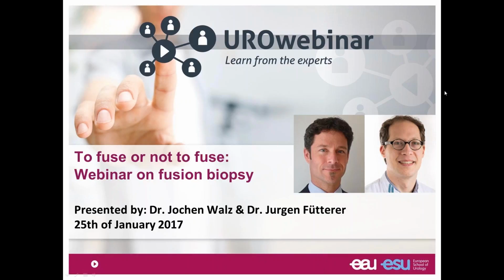Go ahead. So what we know from literature, also from our own experience, is that if you have a patient with rising PSA and a negative first TRUS biopsy session with 10 or 12 cores, in general we only perform MR targeted biopsy of the lesion rather than sampling the entire prostate. If you look at the comparison between TRUS-guided biopsy versus MR targeted biopsy, I think the yield is significantly higher with MR targeted biopsy compared to the TRUS approach.